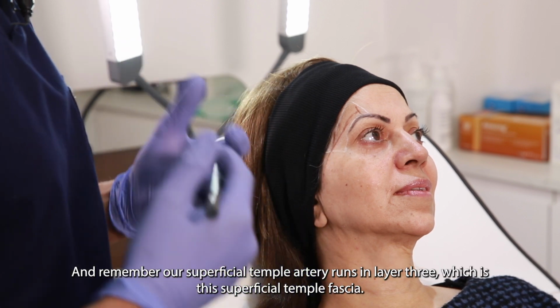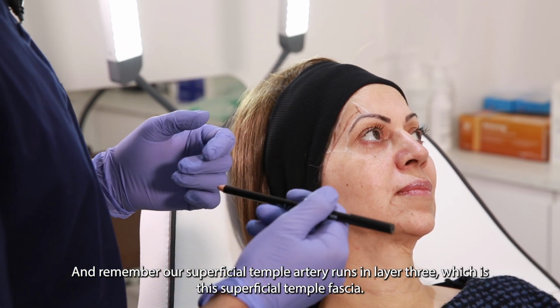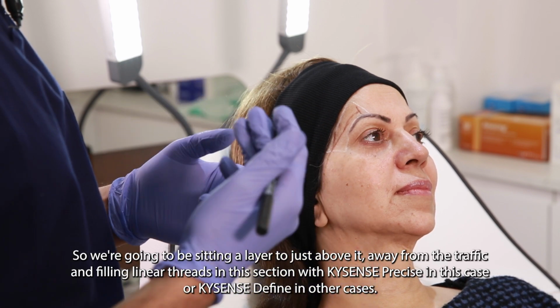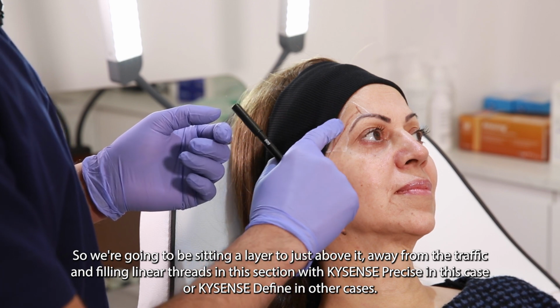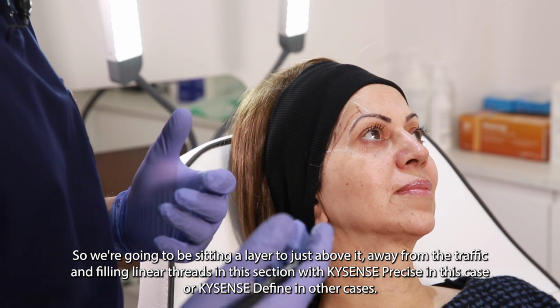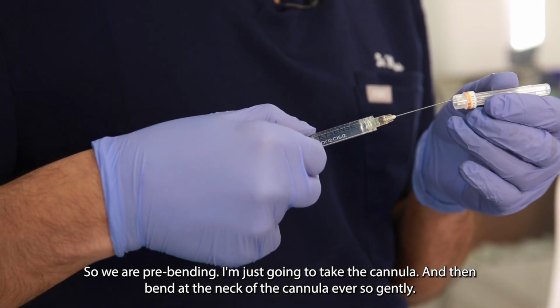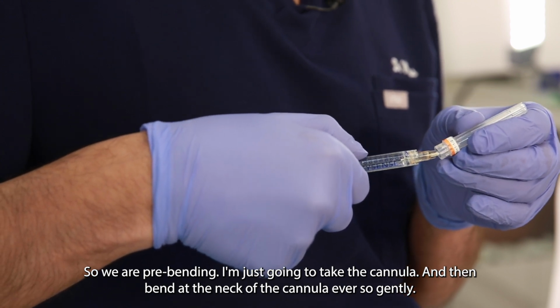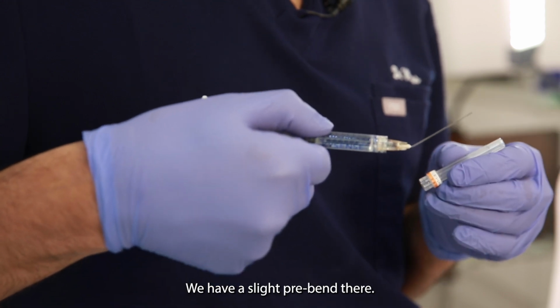And remember, our superficial temporal artery runs in layer 3, which is the superficial temporal fascia. So we're going to be sitting in layer 2, just above it, away from the traffic, and filling linear threads in this section with KYSENSE precise, in this case, or KYSENSE define in other cases. So for the pre-bending, I'm just going to take the cannula and just bend it at the neck of the cannula ever so gently. We have a slight pre-bend there.